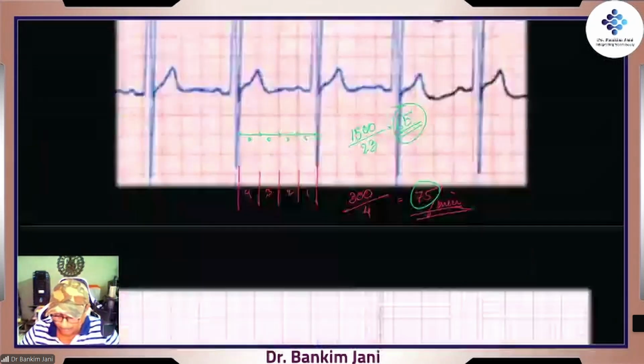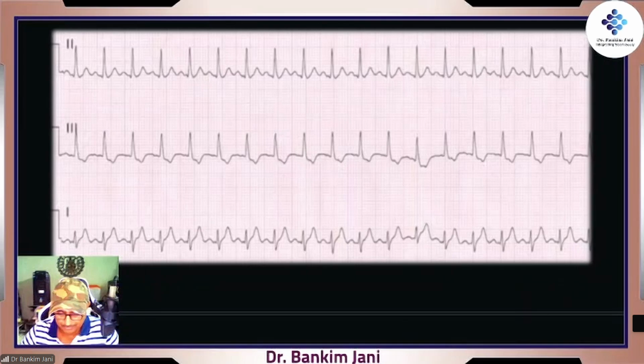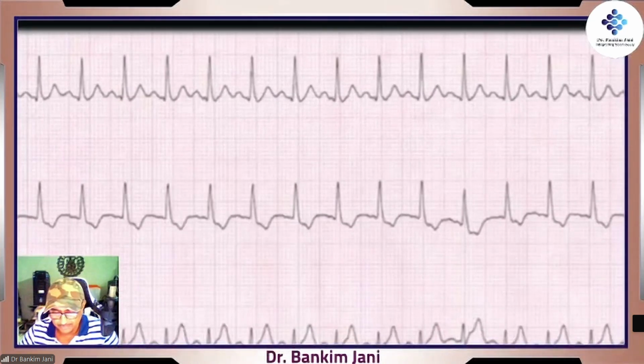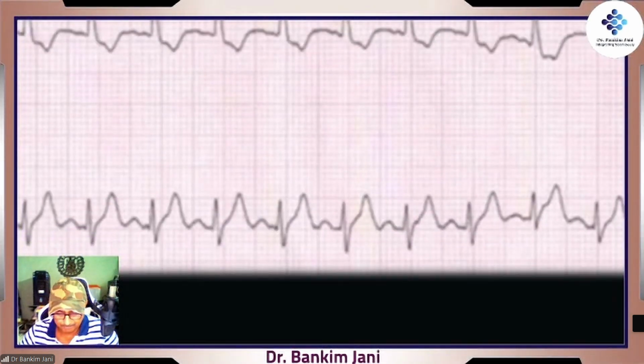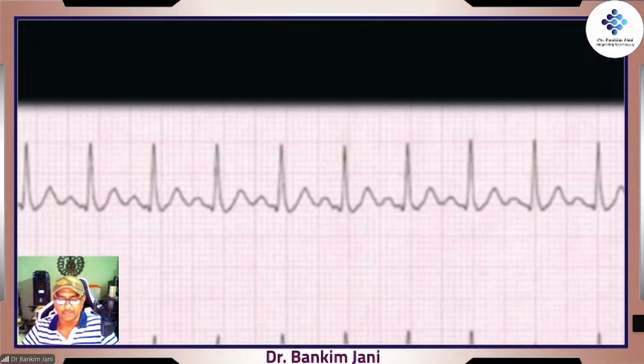चलो, one more. Answer this. This is wonderful. So many pathologies are there. We'll learn this thing, but abhi ke liye, give me the heart rate. Let's take this heart rate.